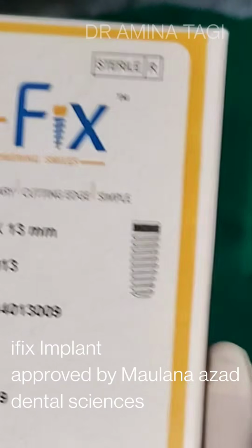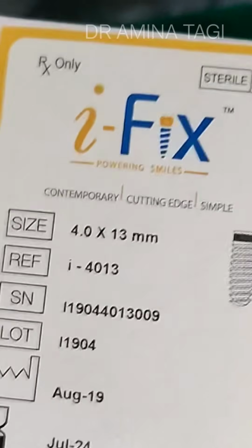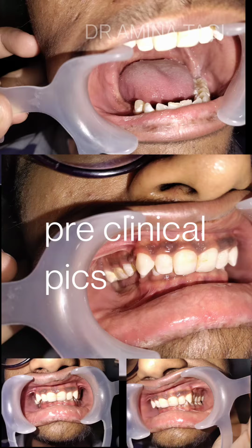And the implant that I'm going to use is an iFix implant, which is an Indian brand, and they have an exact simulation of the Nobel BioCare implant kit. After taking the clinical pics, finally let's go to the surgical technique.